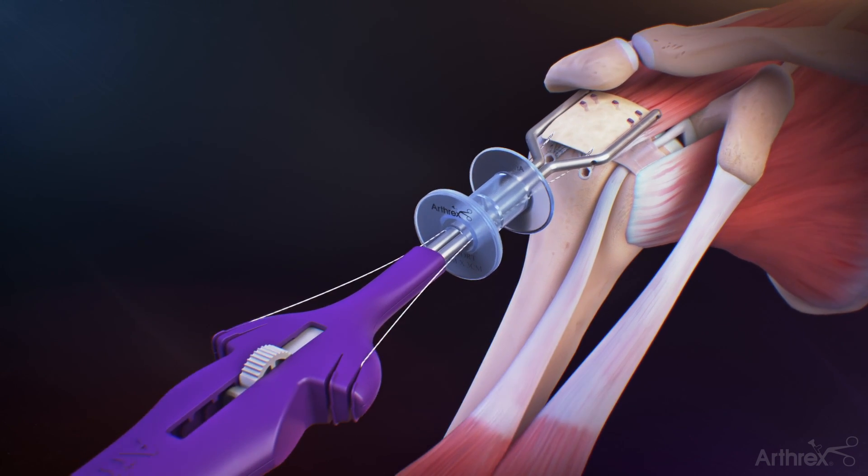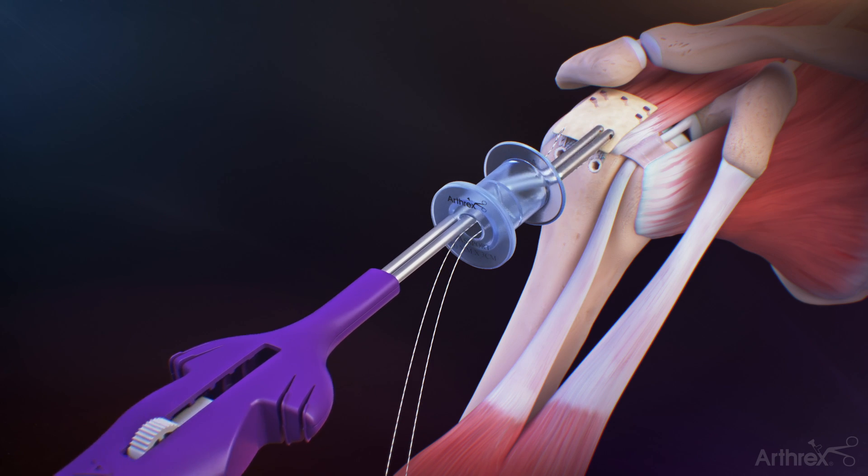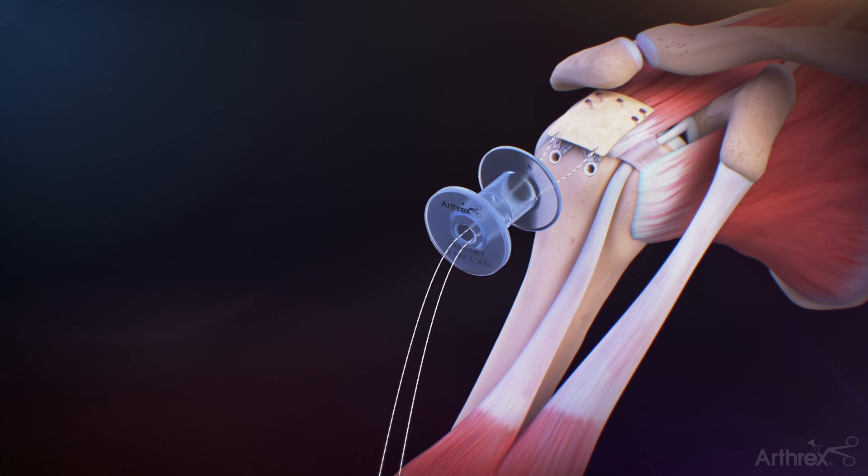Uncleat the remaining two sutures from the graft spreader handle. Retract the arm of the graft spreader and carefully remove it from the lateral portal.